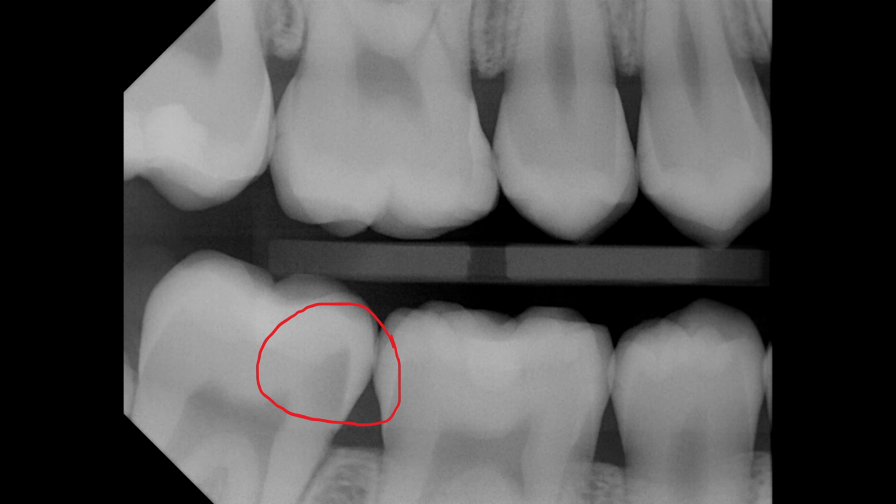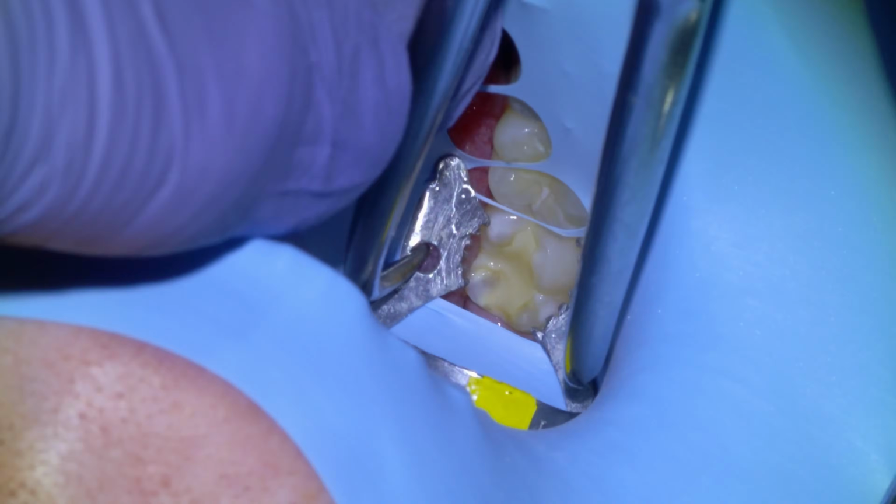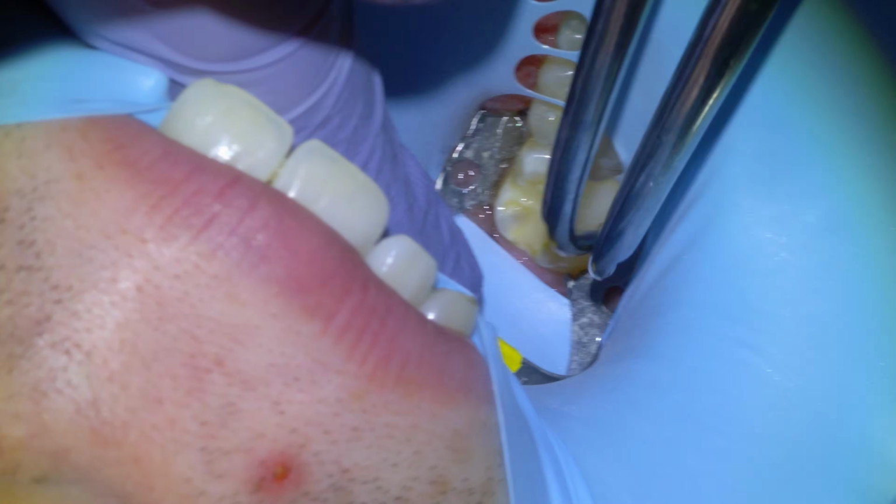You can see that there's a pretty deep lesion that's into the dentin. There are no other lesions on this x-ray that require treatment, so we're just going to do the 4-7 MO with Equia Forte in this video.